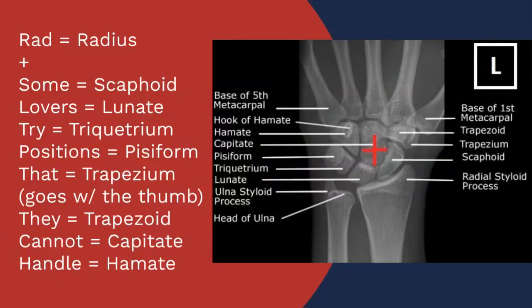From the radial styloid process, remember this mnemonic: 'Some Lovers Try Positions That They Cannot Handle.' Starting from true anatomic position, the left marker indicates moving from the proximal lateral row of the carpal bones. The scaphoid is the proximal-most lateral carpal bone, and progressing toward the medial aspect: scaphoid, lunate, triquetrum, pisiform.